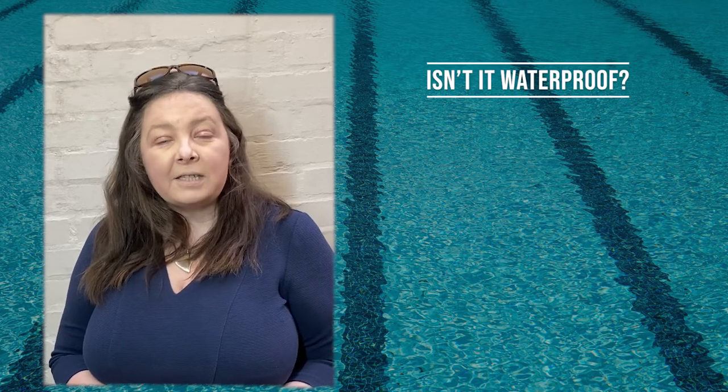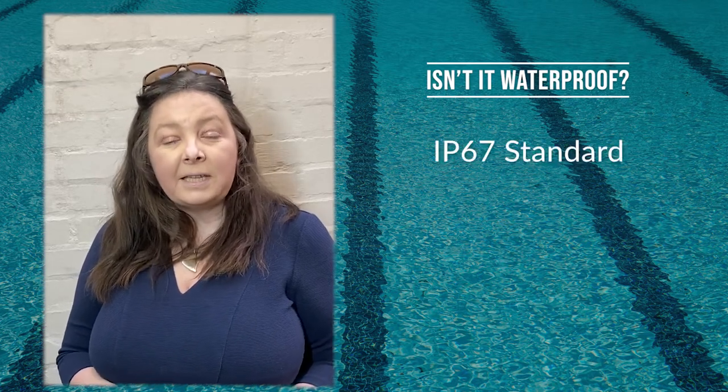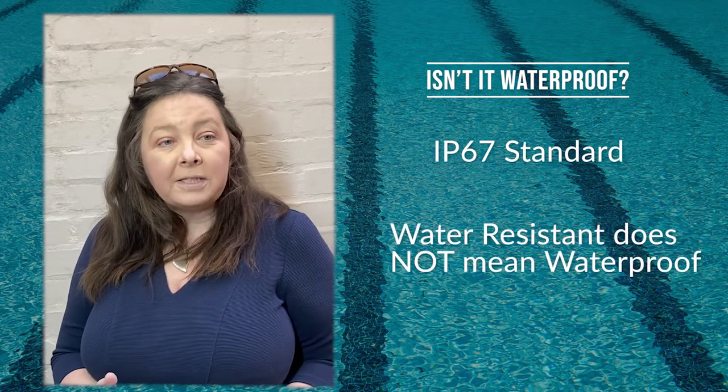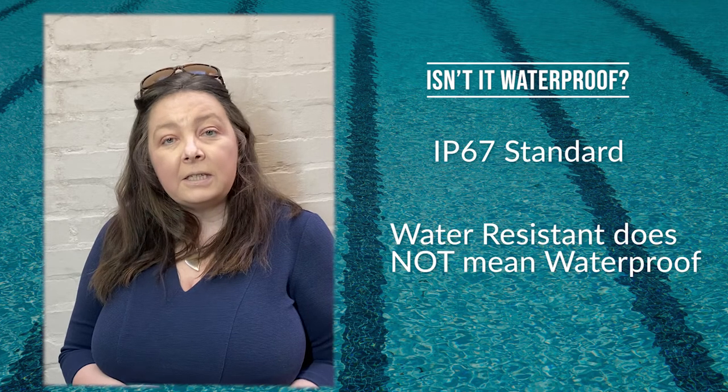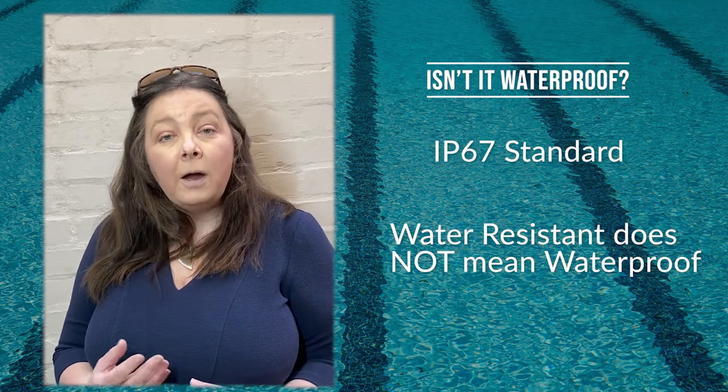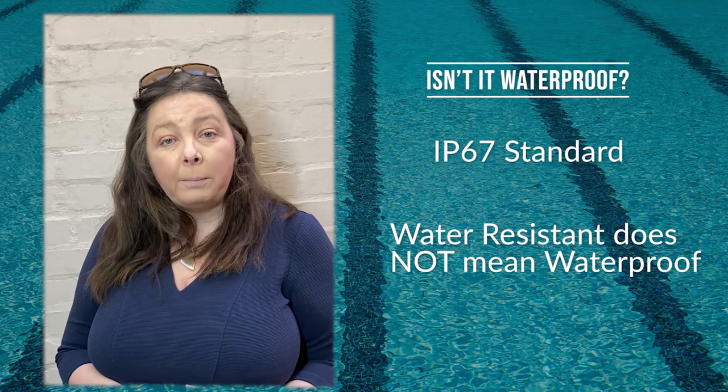Libra sensors are water resistant to IP67 standard. This doesn't mean that they're waterproof and the two terms are not the same thing. They've been tested in certain conditions, which is why the instructions give you a maximum of 30 minutes to a depth of one meter.